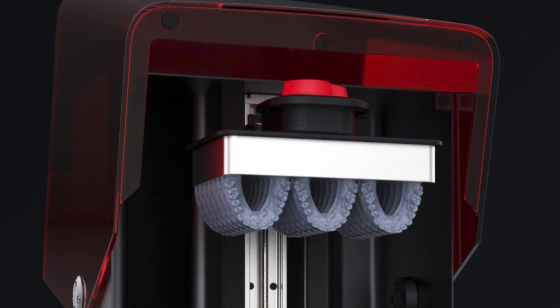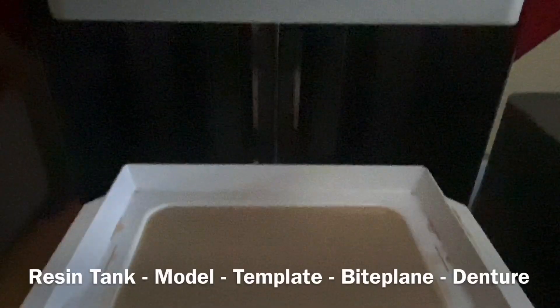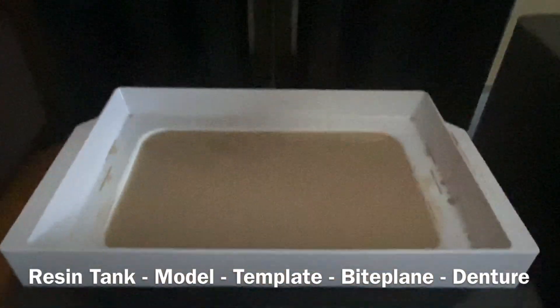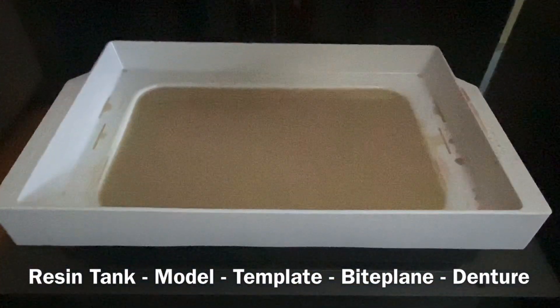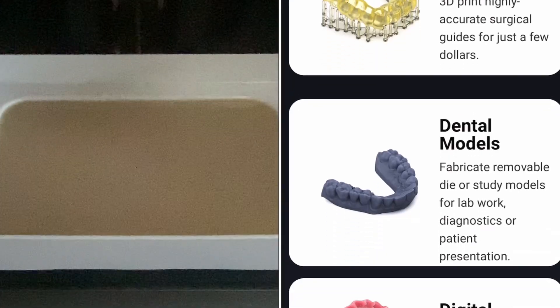When you open the hood you'll get a good look at the print platform, which is quite generous and quite big - this is for you to do more projects. When it's printing, this print platform is going to dip down into the resin tank. The resin tank holds the different resins you're going to use, whether you're doing a model, printing a template for placing implants, bite planes, or dentures - there's a whole bunch of different projects.